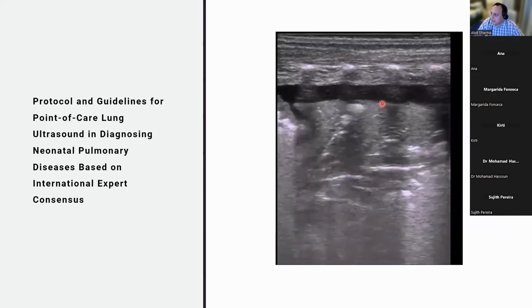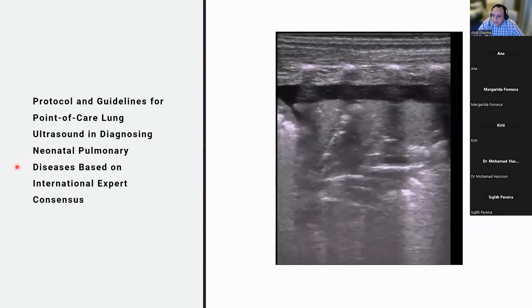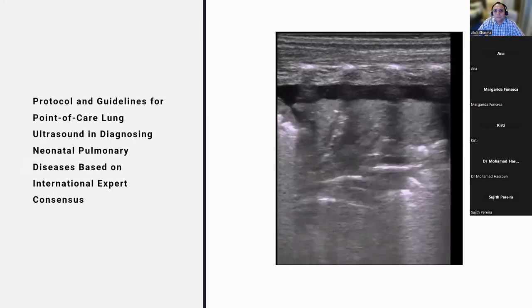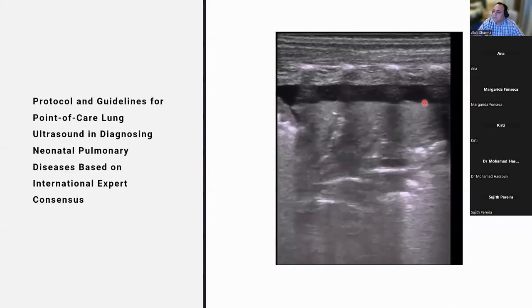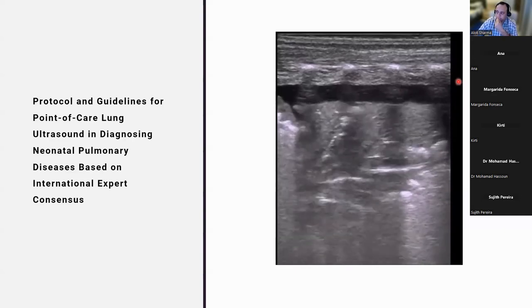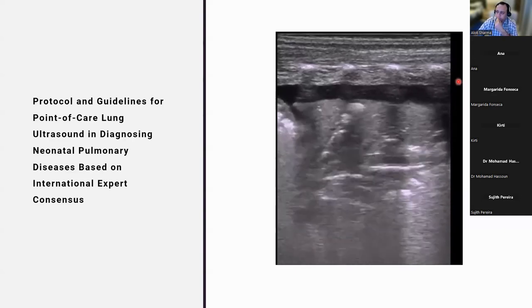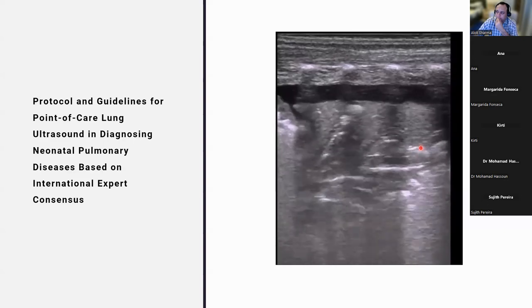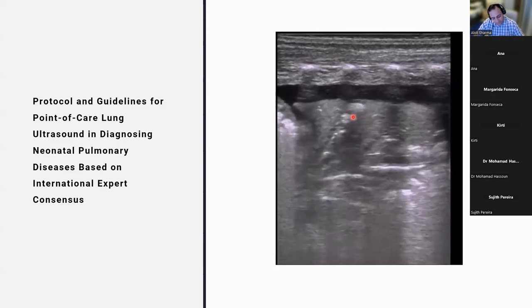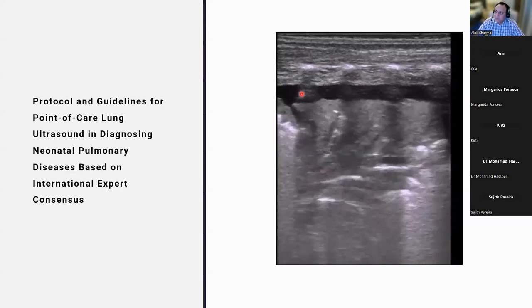Now, what do we think about this? Kirti, would you like to have a go at this? Okay, so we can see the parietal pleura, the ribs up there, and pleural effusion. And then underneath that, I don't think we have visceral pleura here. And there are these parallel static bronchograms, and also some dynamic bronchograms in the upper part, maybe, that are coming in. Yeah, that one. So again, it could be compressive atelectasis with some consolidation.